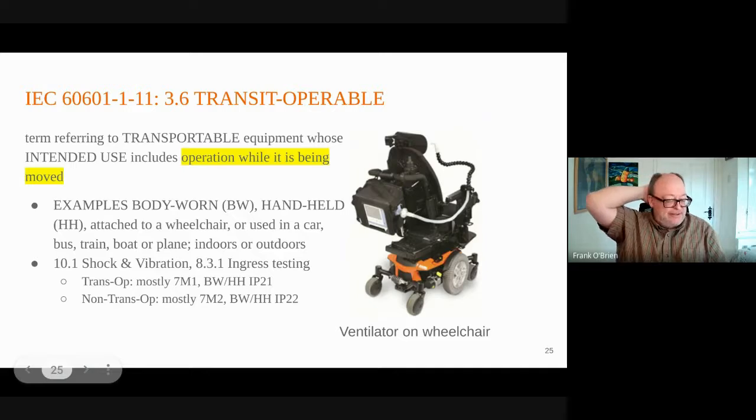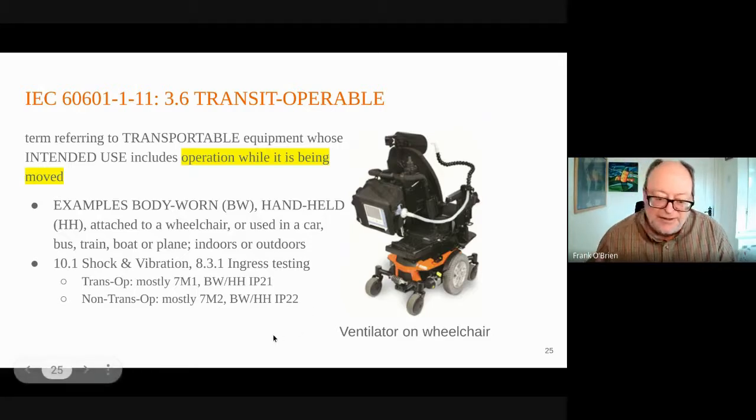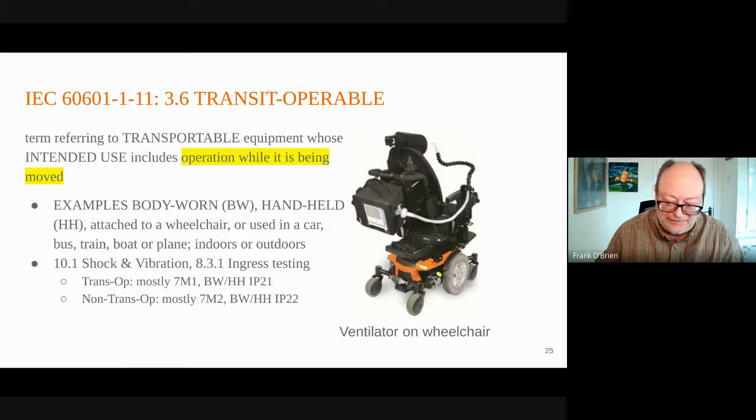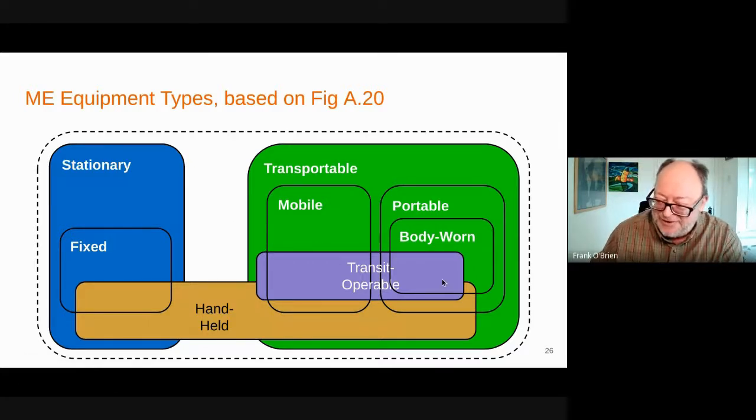There are a lot of active implant accessories, or the insulin pumps and the glucose meters, where they're handheld or body worn, and they would need these tests. And so a lot of legacy ones got caught up with this stuff. And of course, you're going to maintain basic safety and essential performance. And I suppose the idea is that in the home, it's the whole Pepsi syndrome thing, the Coca-Cola, whatever, it's flying around and falling on everything. Okay, coffee. Which is why we should do a 200 milliliter spill test, I guess, for Budweiser and Carlsberg, depending on the patient.